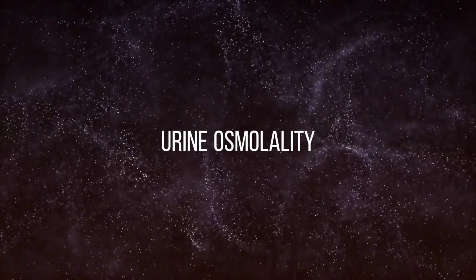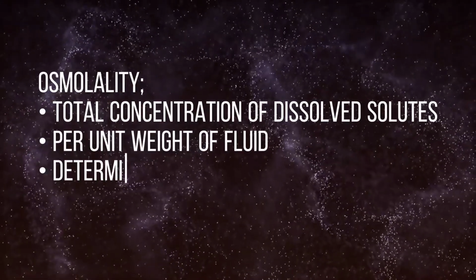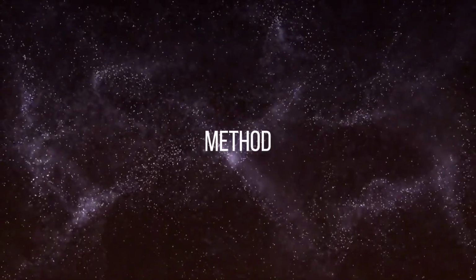Now, let's talk about urine osmolality. Osmolality measures the total concentration of dissolved solutes per unit weight of fluid. It determines the movement of water between fluid compartments. Let's see how we measure urine osmolality.